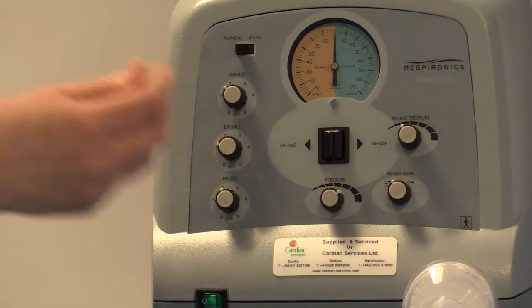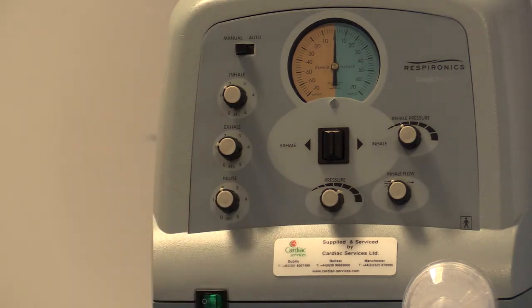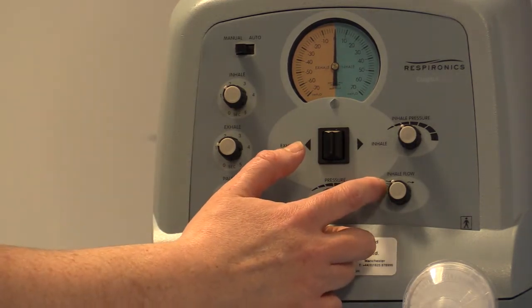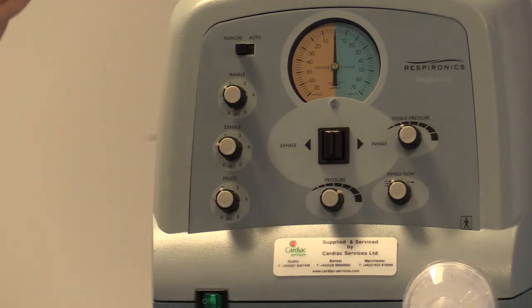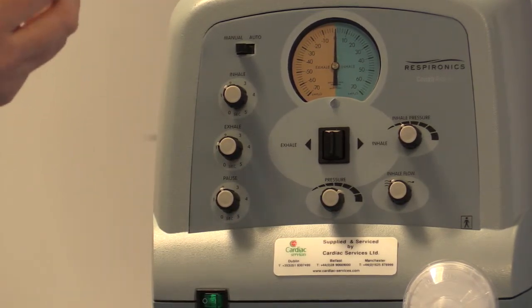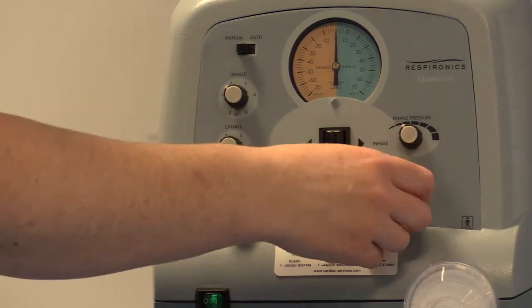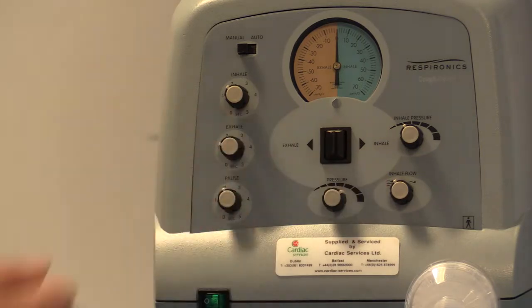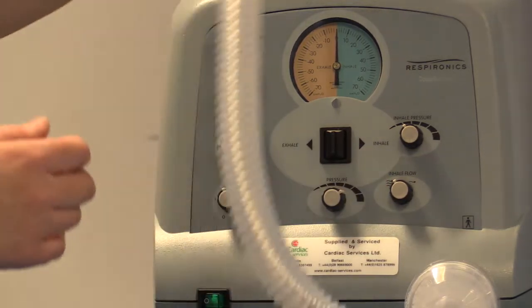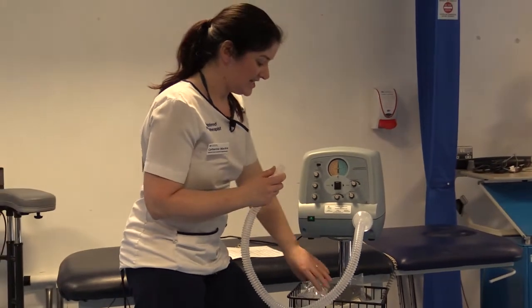If you've set your exhalation pressure at 25, then your inhalation pressure will be around 12 to 13. The next knob at the bottom is called your inhalation flow. There are three arrows on the left-hand side and one arrow on the right-hand side, which allows you to adjust your flow. It depends on the type of patient — if you're concerned about giving too much flow, such as with a pediatric or compromised elderly patient, you might want a lower flow on the right-hand side. For a higher flow, equivalent to about 10 liters, you go to the left-hand side.